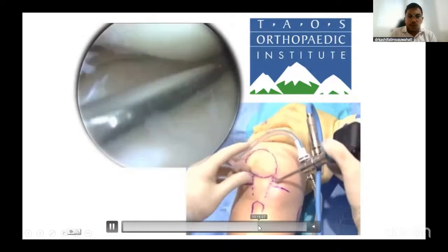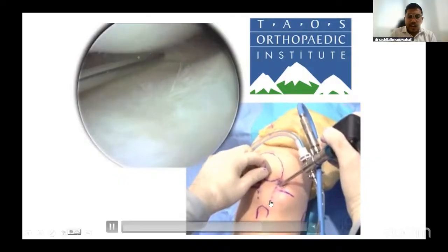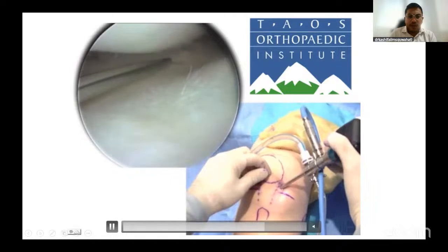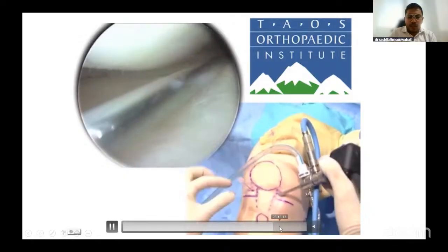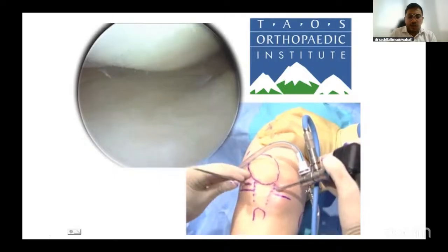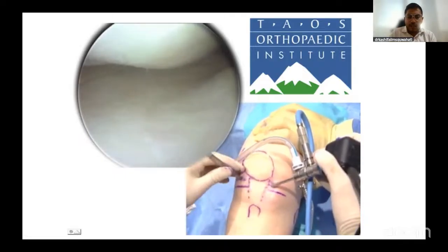So we want to do some medial meniscus work. We need to have this in the right trajectory, and so the portal is made only once we are okay with visualizing the needle. Once you take out the needle, you replace it with the knife. Again, keep good control over the knife with your fingers, and be stable while making the incision so that you don't injure anything inside.